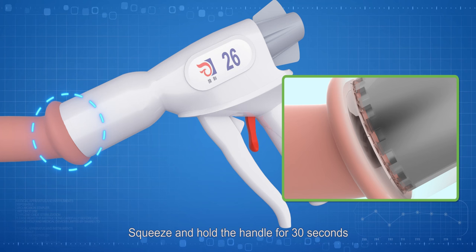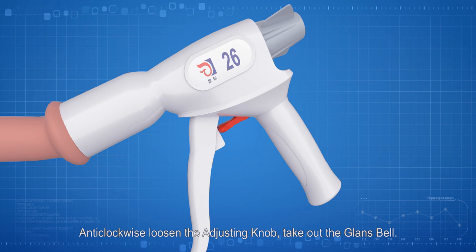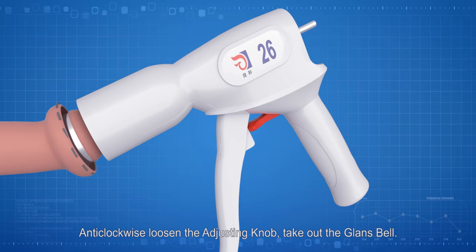Return the safety knob to the original protective location to help the trigger homing. Anti-clockwise, loosen the adjusting knob. Take out the glans bow. Separate the cut foreskin from the penis.